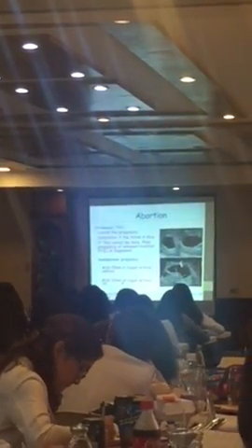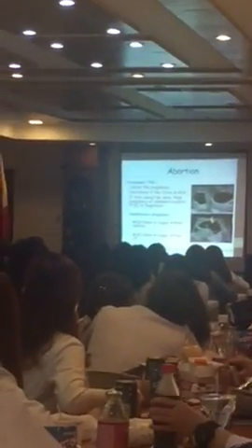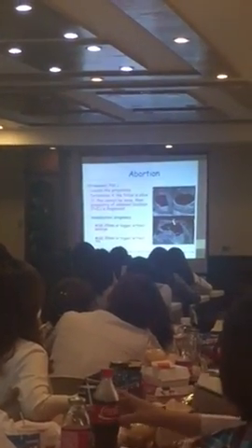Then we go to miscarriages or abortion. So as I mentioned earlier, you take note of the location, and at the same time, if you have a patient with a period of amenorrhea and a positive pregnancy test, but the sonologist was not able to see any GS or any sonologic signs of pregnancy, then the term is PUL, pregnancy of unknown location. Meaning, she is pregnant, but we do not know where the location is. So you need to repeat it after 3, 5, or 1 week, depending on the amount of your beta-HCG.